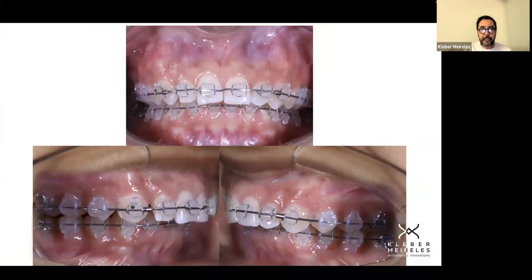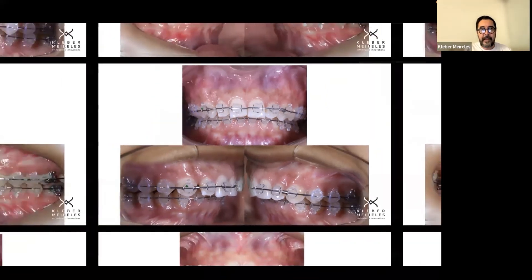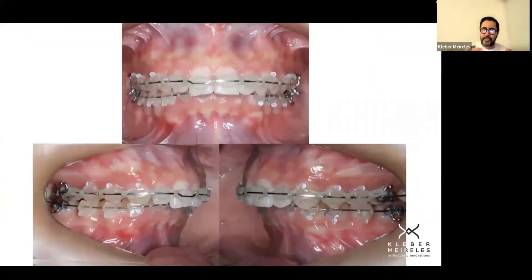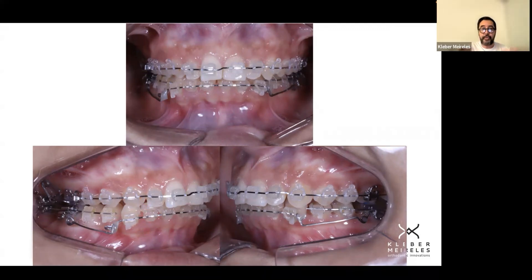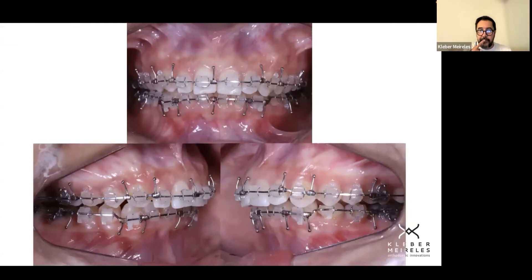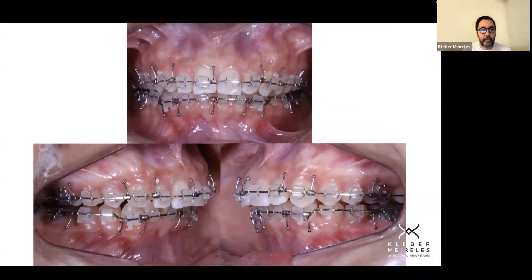As you can see here, we have a good protrusion at this moment, opening space distal to the lateral incisor. I understood that at this point I needed to do something different for the curve of the teeth. I used a three-piece approach with a cantilever to do the intrusion of the anterior teeth without protruding them. And here we have it. After a while, everything was set for surgery. We put the hooks — I usually use seven hooks: between the central incisor, mesial and distal to the canine, and mesial to the first molar. Our surgeons agree with this positioning of those hooks.